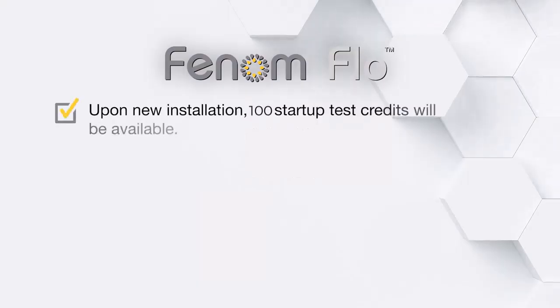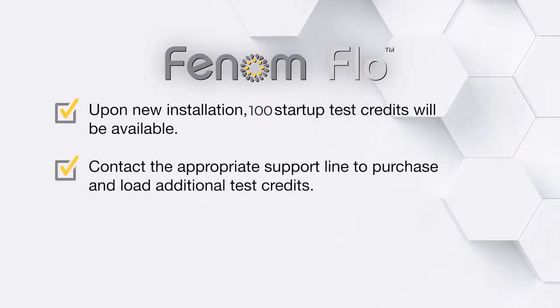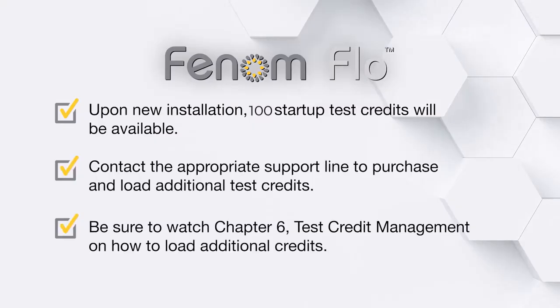Upon new installation, 100 startup test credits will be available. Contact the appropriate support line to purchase additional test credits. Be sure to watch Chapter 6, Test Credit Management, on how to load the additional credits.